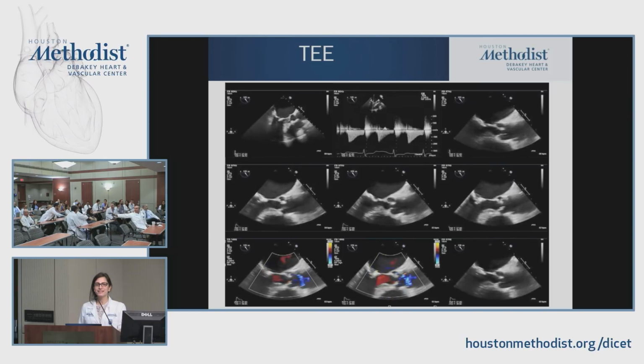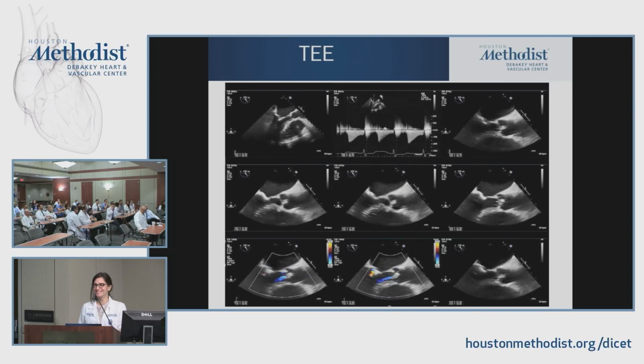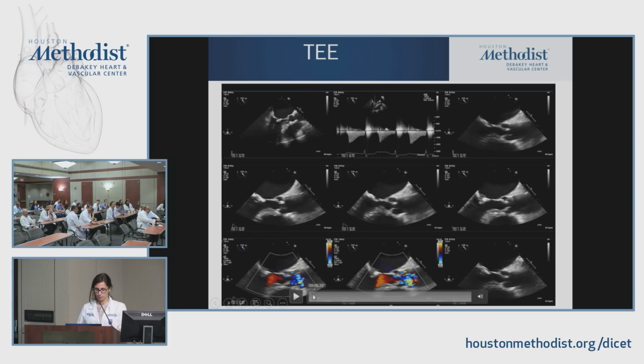Yeah, we'll be discussing that. The patient has significant RV dysfunction or significant tricuspid regurgitation, low flow, low gradient, similar to what we have in the aortic valve. There's a new concept that came from the Mayo people, low flow, low gradient mitral stenosis. Yep, gradients are very flow dependent. Very true, and we'll talk about that more.